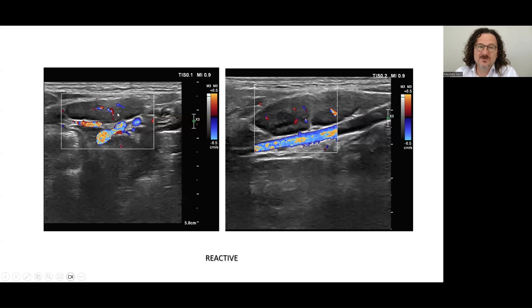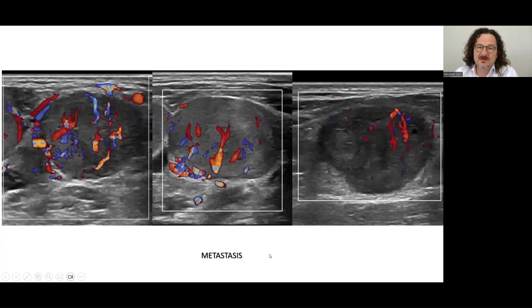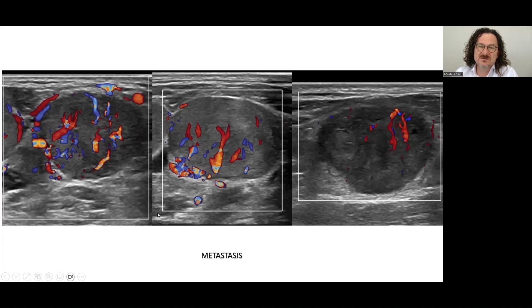This is a reactive lymph node — not much increased parenchymal vascularity and the hierarchy is preserved. These are two different cases. In this one, you see the capsular vascularity, intratumoral shunts, amputations, angulations — squeezed and distorted vessels. These are all abnormal findings.